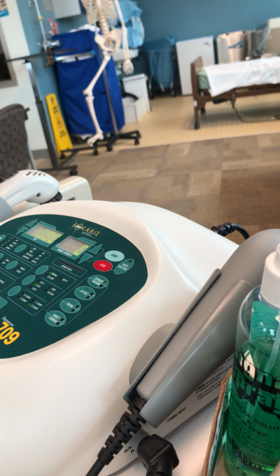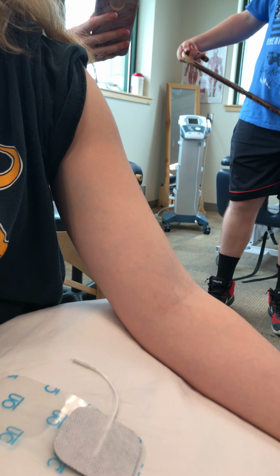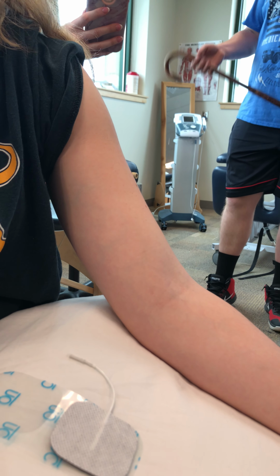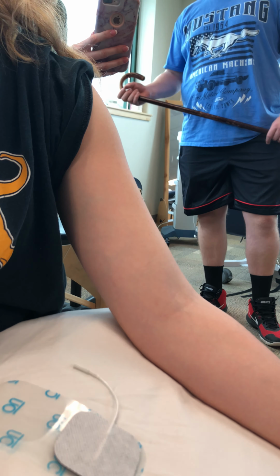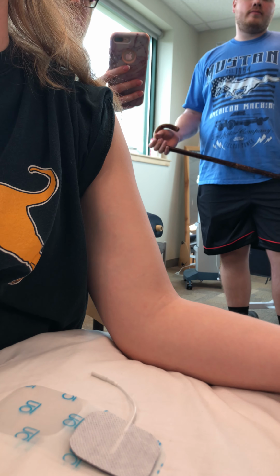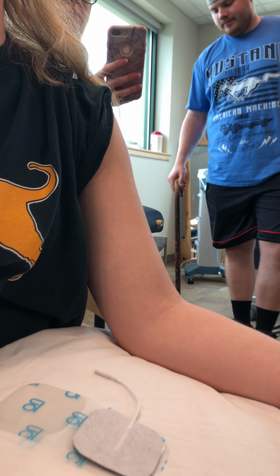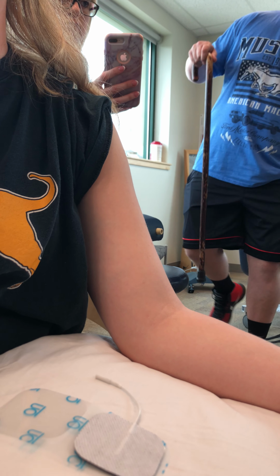This is why you need to know your kinesiology, because you need to know where these muscles are to stimulate them. What kind of current? You have a choice of two. It's AC current, and it's going to be pulsatile because it's going to be more comfortable. And the pads have to be at least how far apart if it's AC current? 3 to 4 inches? No, it's 1 inch, because it's AC. Direct current is 3 to 4.